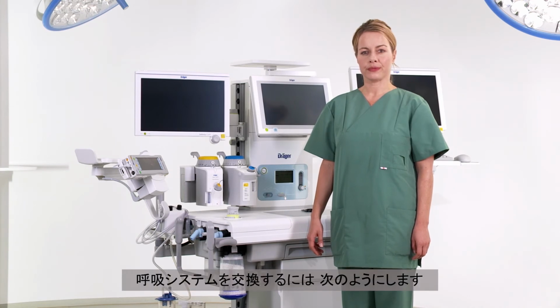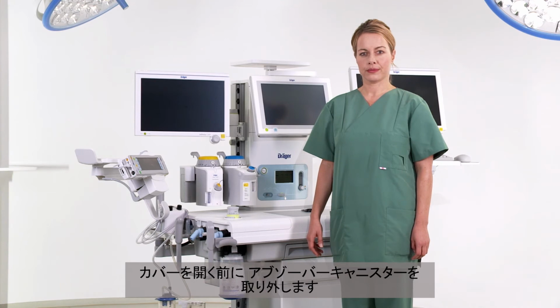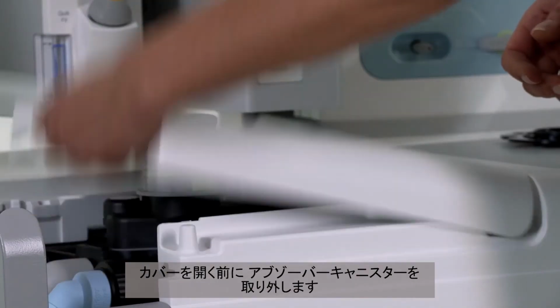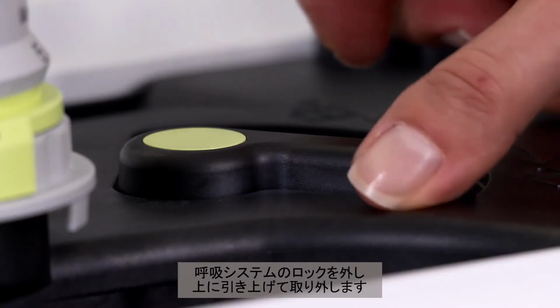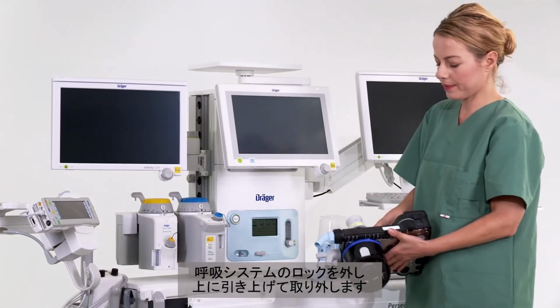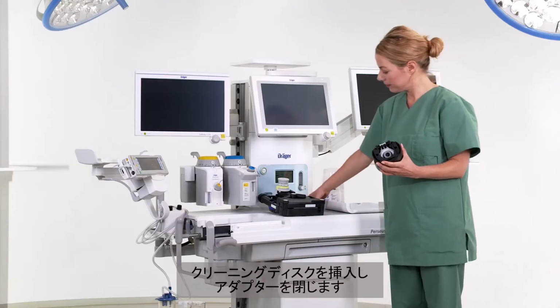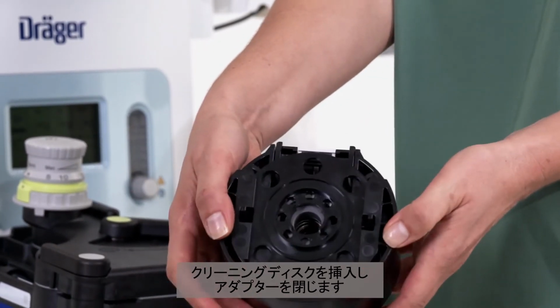To replace the breathing system, do as follows. Remove the absorber container before opening the cover. Unlock the breathing system and pull it upwards to remove it. Now unscrew the click adapter. Insert the cleaning disc and close the adapter.